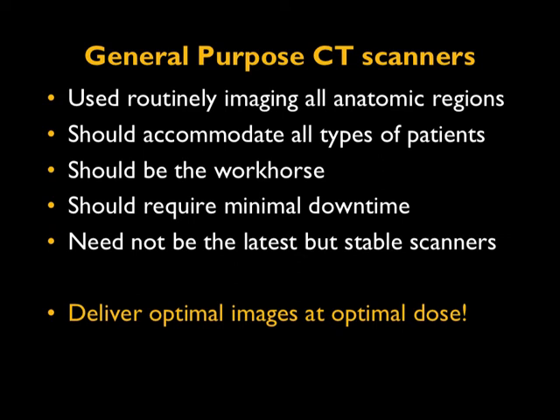It should require minimal downtime. This is very important for remote clinics, clinics which have very few CT scanners, or clinics located in a very remote area. The demand for minimal downtime is key in the selection process. A general purpose CT scanner doesn't necessarily have to be the latest scanner, but it has to be a stable scanner, so it works routinely and correctly. It's also important to remember that these scanners deliver optimal images at optimal dose.